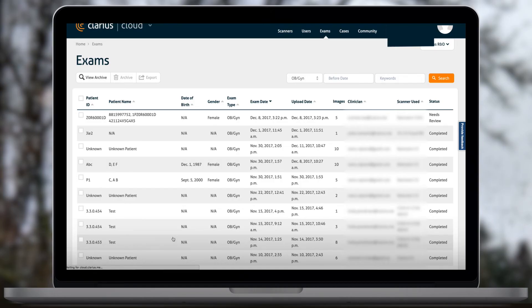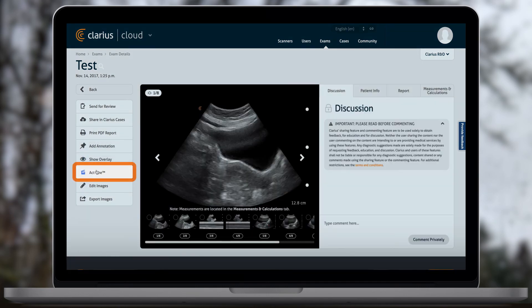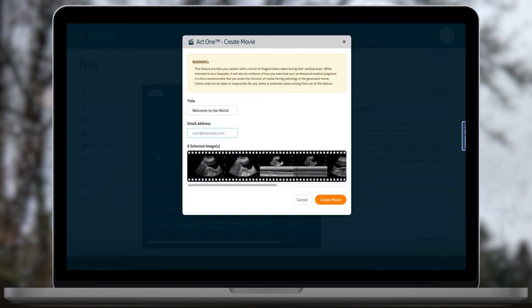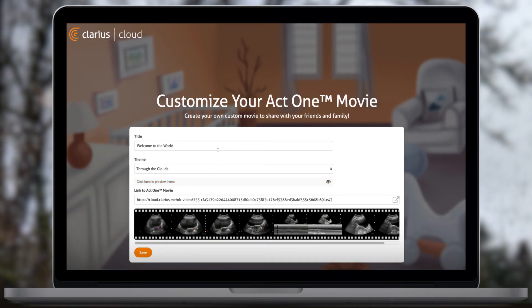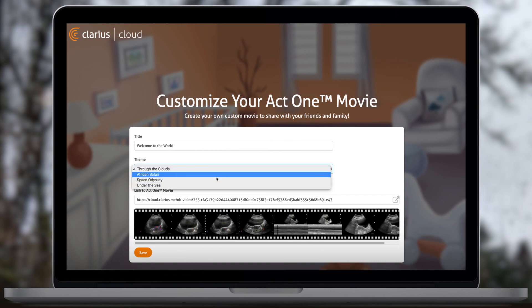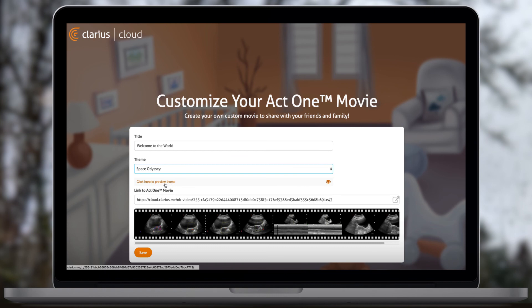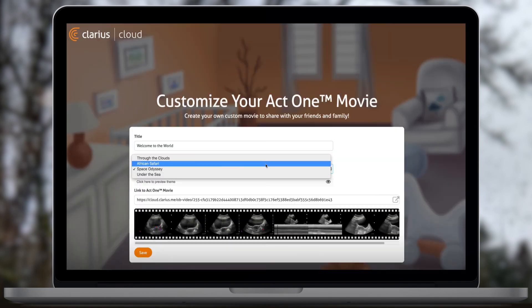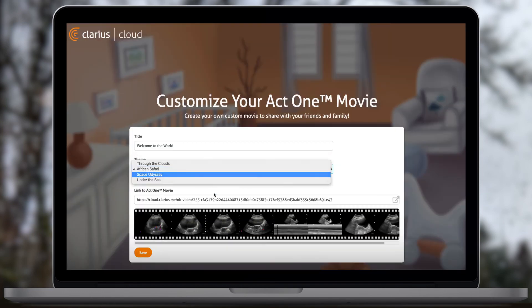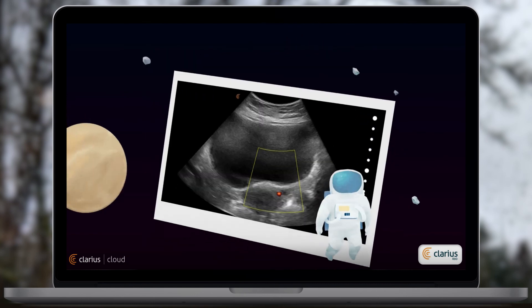Act 1 allows you to share an animation movie of images and clips with expecting patients. To create an Act 1 movie, select the images you would like to share with the patient and click on Act 1. Enter the patient's email. The patient will be able to customize the movie later. To customize your movie, click on Customize Movie. You can change the title of the movie and choose between four themes. To view your movie, go to the link or click on View Movie in the email. You can share this link with friends and family or on social media. Act 1 is available for OBGYN exam workflows.